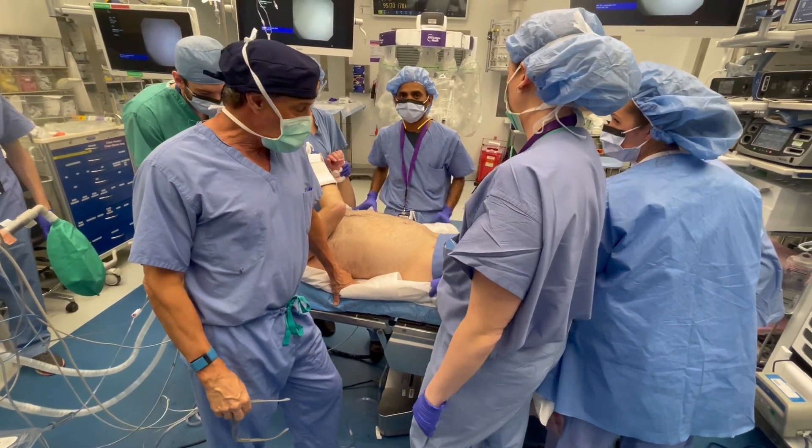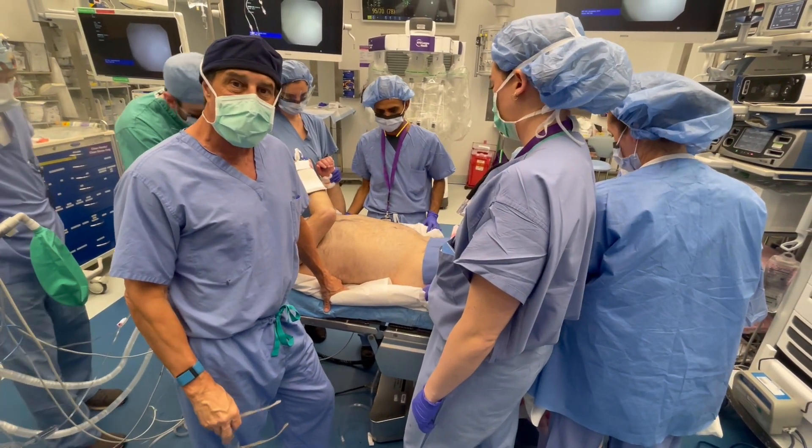Hi, Robert Cervoglio from New York City. We're going to show you how to position the patient quickly and not waste time.